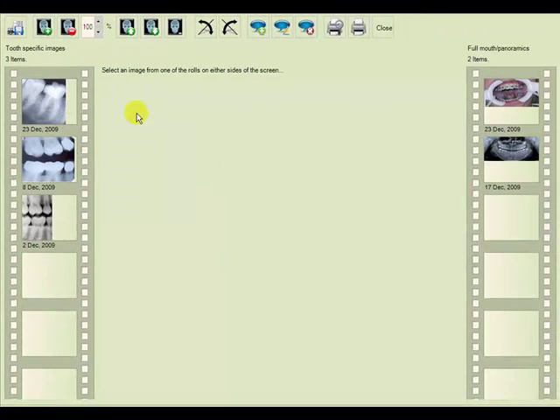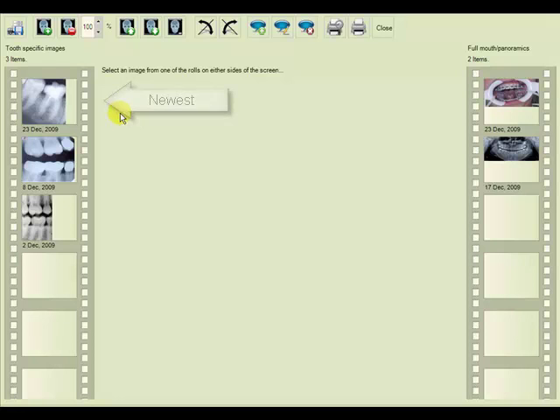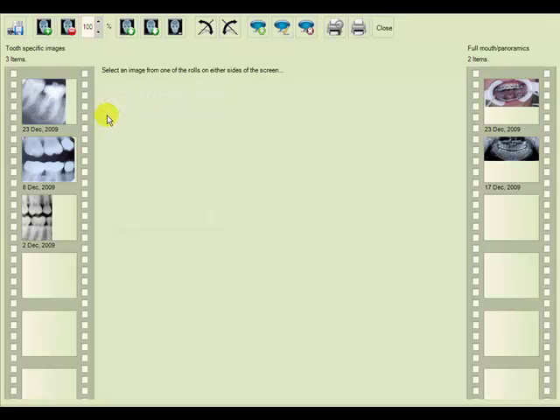Annotations are covered in part two of the chart management of X-rays tutorial. The images are also displayed in chronological order, with the newest images on the top and the oldest images on the bottom.